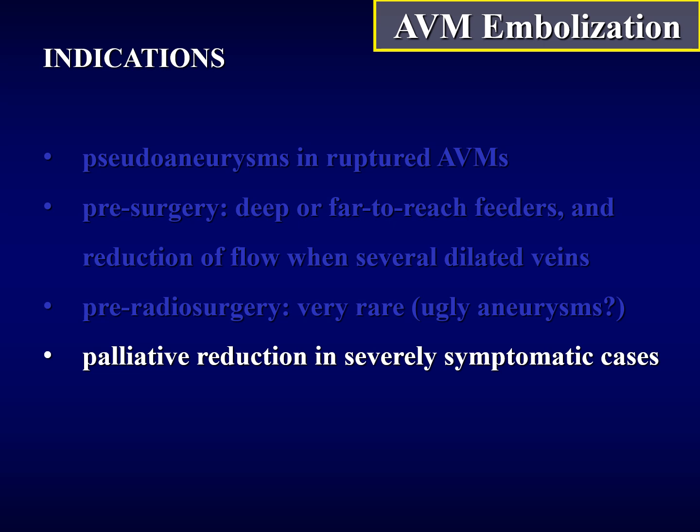Neurologic symptoms can be improved in very big and large AVMs, which cannot be completely resected, but they might improve by a palliative reduction.